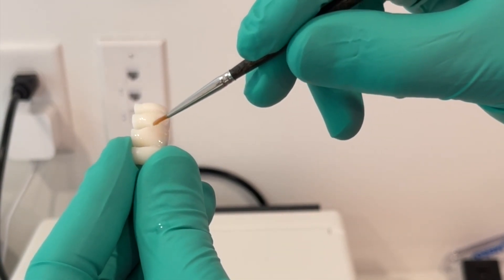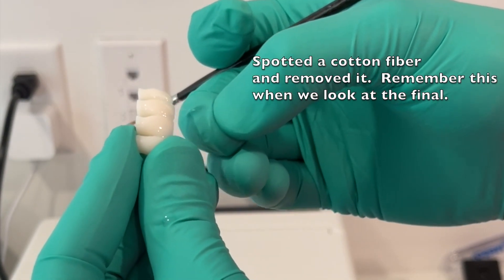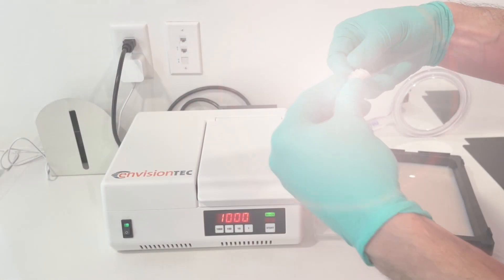I did have some cotton that had somehow gotten on this as I was working, so you'll see me pluck it off here. Just to reiterate: not all curing lights are compatible with these 3D printed materials. Our composites cure at a wavelength of about 450 nanometers, so most curing lights are optimized for that wavelength, but these 3D printing materials cure at much lower wavelengths. It's important to have a curing light that is optimized for that purpose.